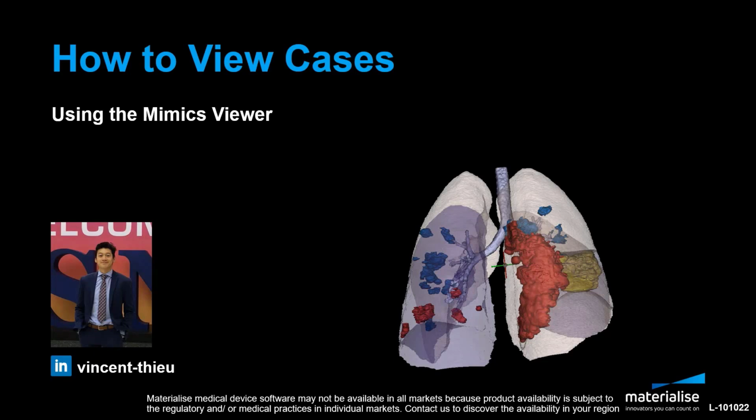As an online visualization and communication tool for medical imaging and 3D models, the Mimics Viewer can be used within hospitals and device companies to efficiently share files and 3D models created in Mimics. With the devastating coronavirus pandemic affecting day-to-day operations, it has become increasingly important to communicate and collaborate remotely in order to make medical decisions effectively.